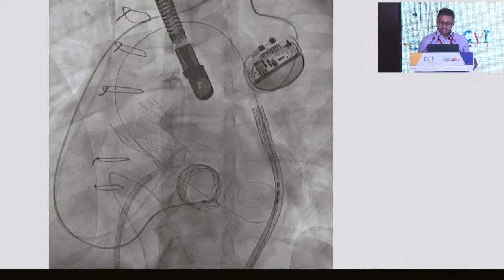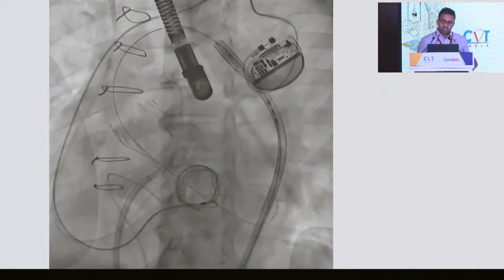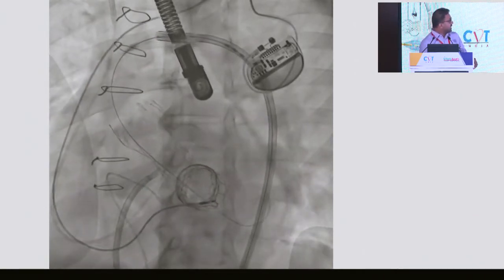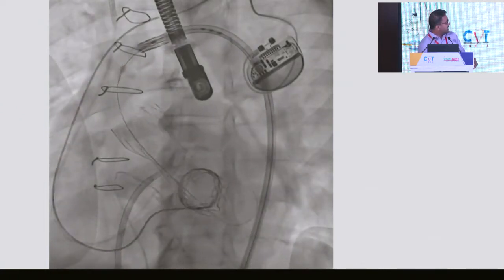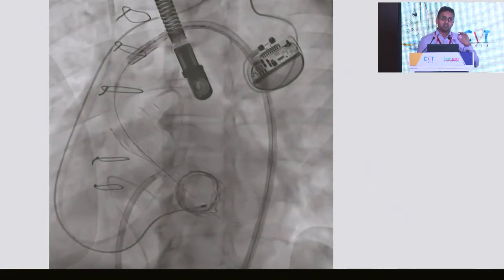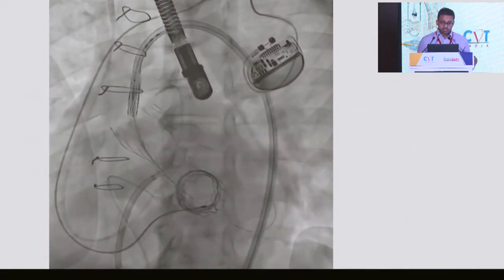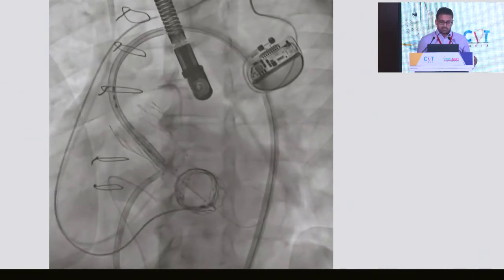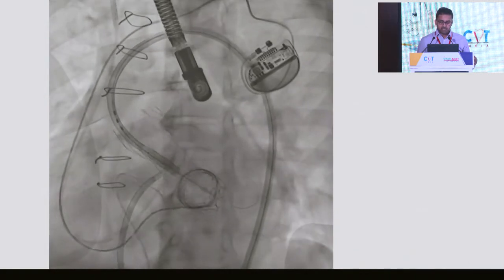And this is a Commander system, and this is important because you can flex the device. You can see here as it goes in. Traditionally, you will end up catching here, but with the flex system, you can adjust it and nicely take it in one fluoro store. You don't need to try multiple times because you should be able to flex the device. And there you go, it's in position.